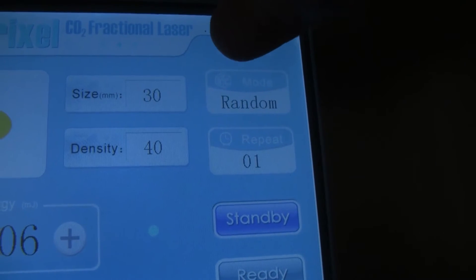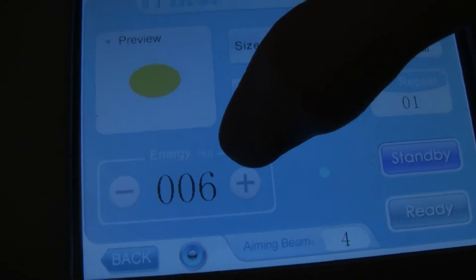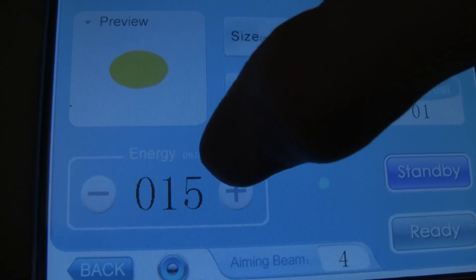We'll go ahead and have repeat on 1 for now. The energy delivered is in millijoules and that goes all the way up to 200 millijoules. We'll go ahead and just put it on 15 millijoules for right now.